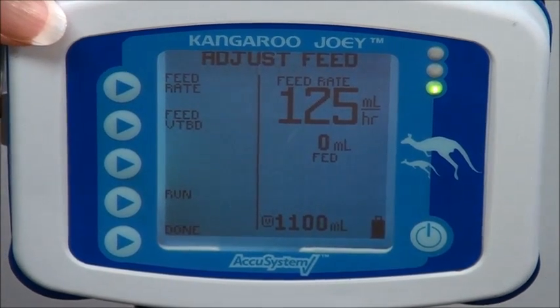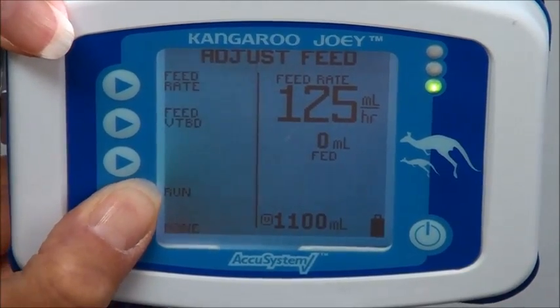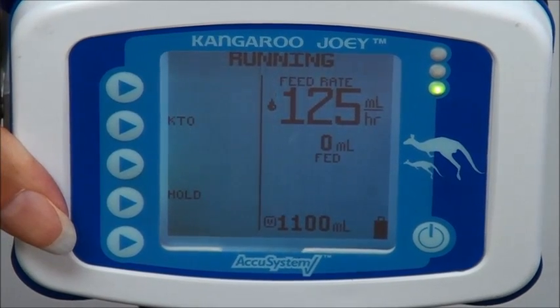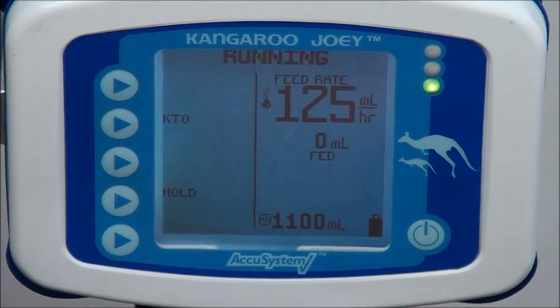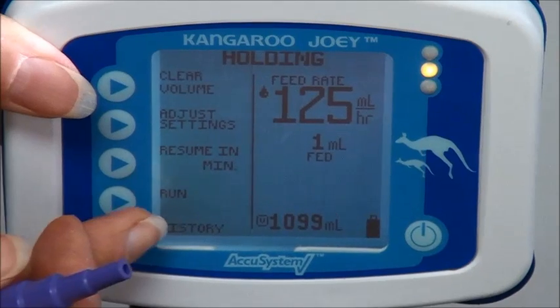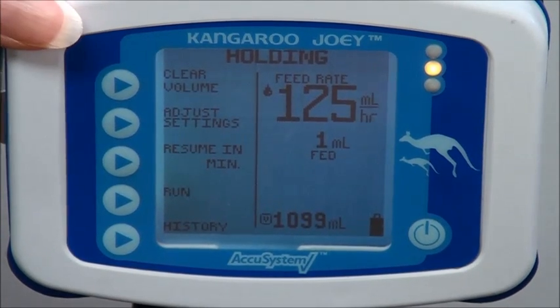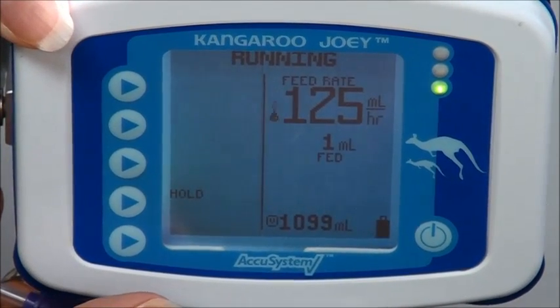So what you're going to do next is we're going to hit the button down here that says run. So we're going to run, and then you'll notice the water droplet coming down, and that's telling us that the food is being delivered to our patient. If we ever need to stop it for any reason, there's a hold button that I can push, and it'll stop the food from going through the tube set. It'll hold for 10 minutes, and then after 10 minutes, if you don't turn it back on to run, you'll get an alarm. When I'm all done, I can just hit the run button again, and it'll start delivering food.